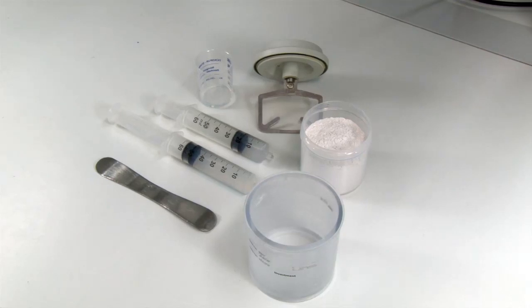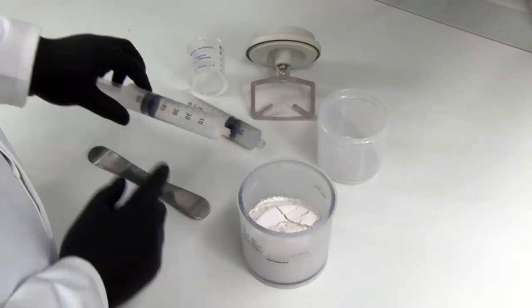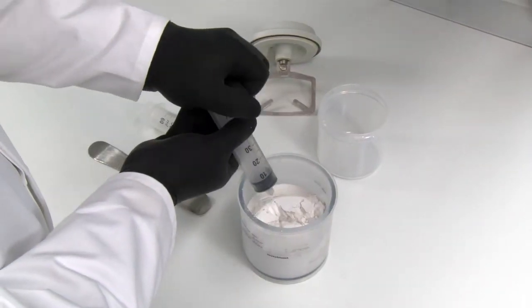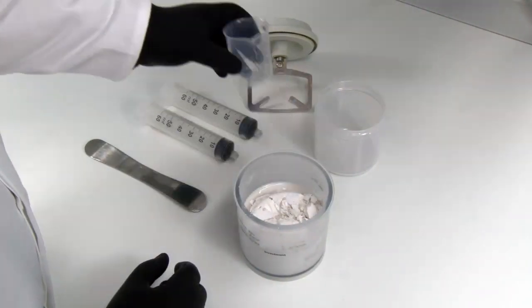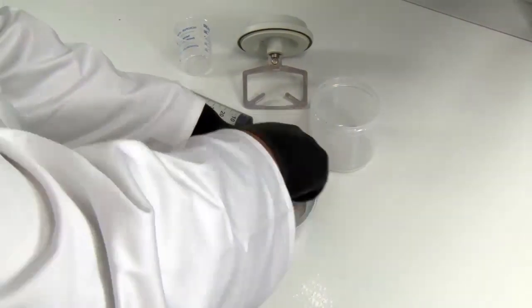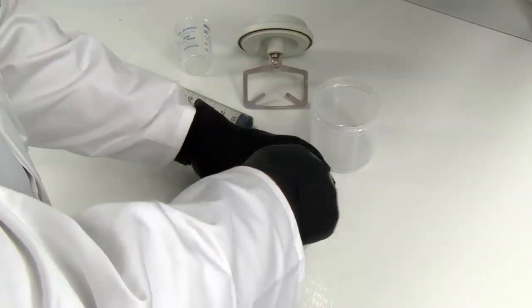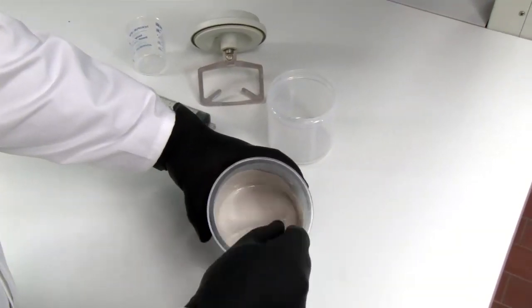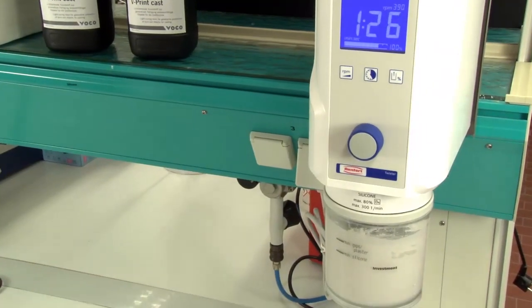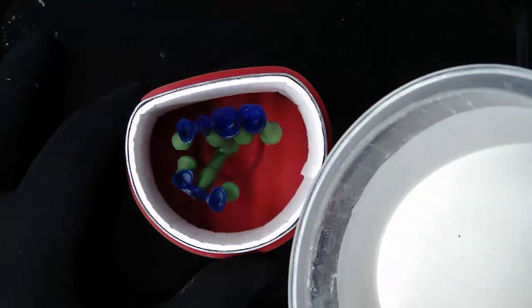These are the components of the investment material, which can vary depending on the used investment material. We start with the investment powder. Add the measured investment liquid, as well as distilled water. This mass must be mixed for 1 minute. Afterwards, it is stirred under vacuum for 1½ minutes to obtain a homogeneous bubble-free mass.